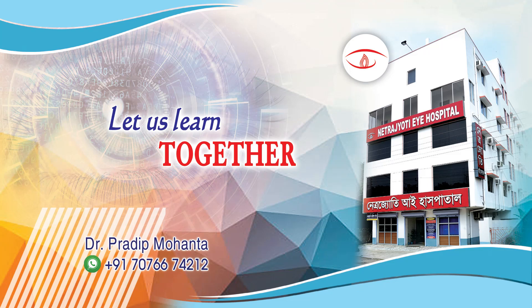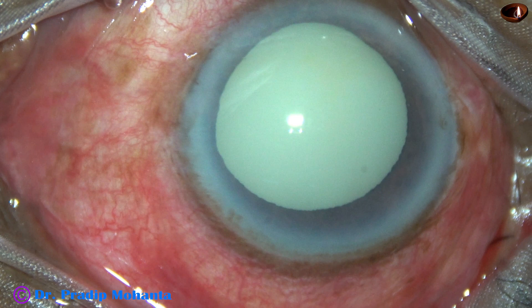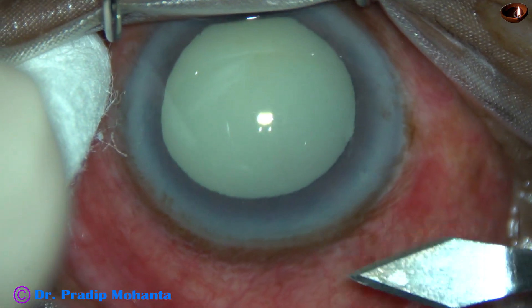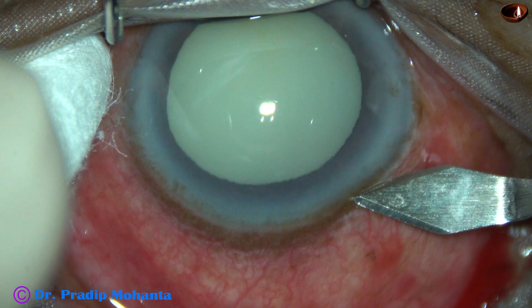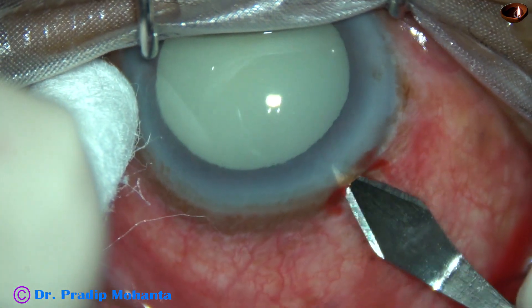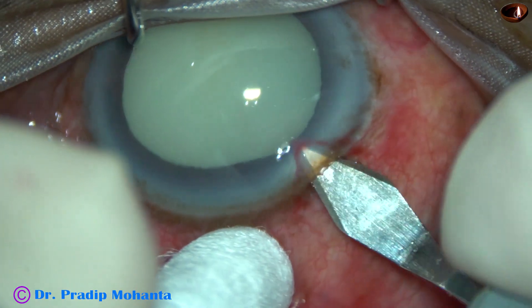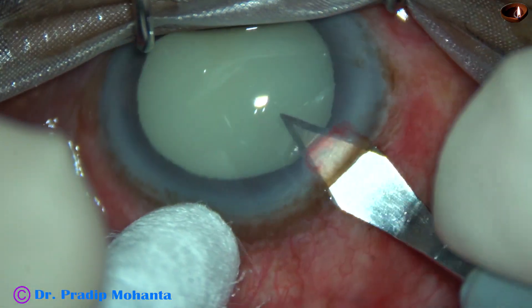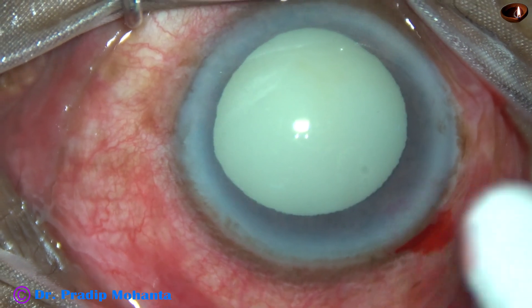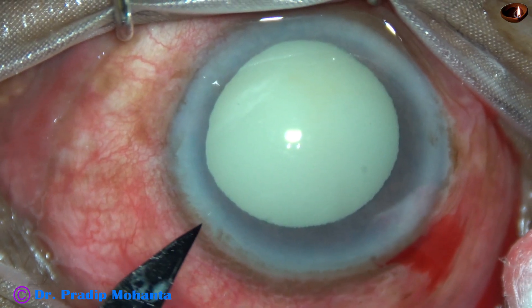Friends, welcome to my workplace at Ranaghat, West Bengal, India. This is a hypermature morgagnian cataract with phacolytic glaucoma. The patient presented to us yesterday with intraocular pressure of 46 mmHg. With anti-glaucoma medications, the pressure has come down today to 22 mmHg, and we have taken this case for surgery.